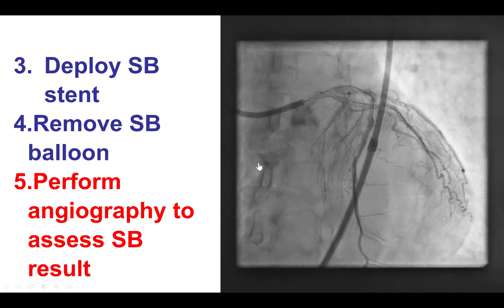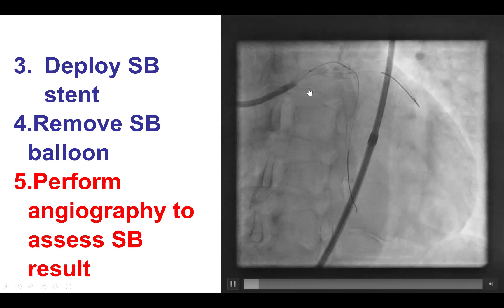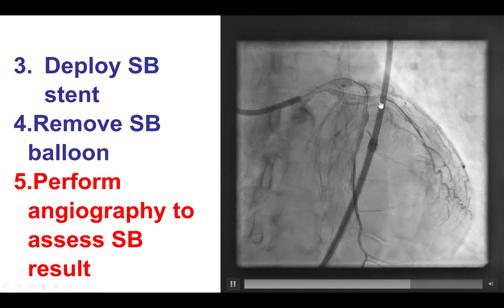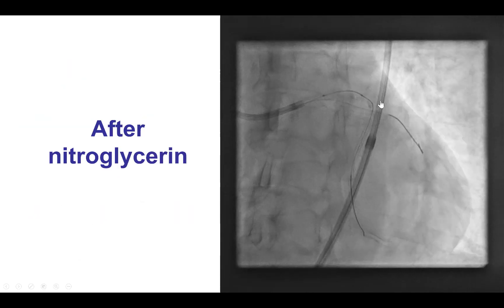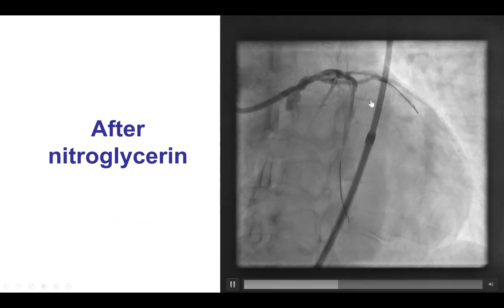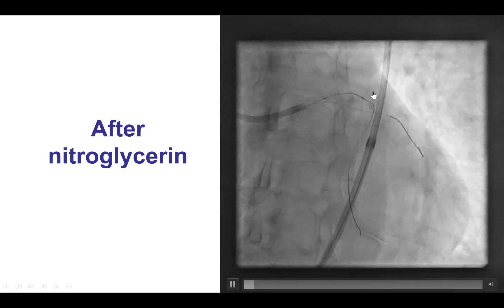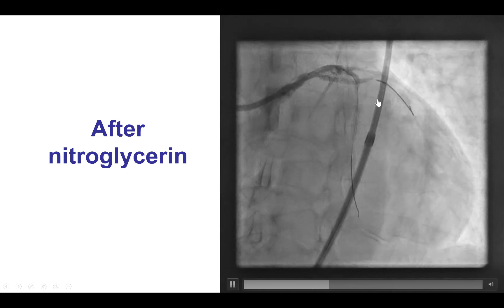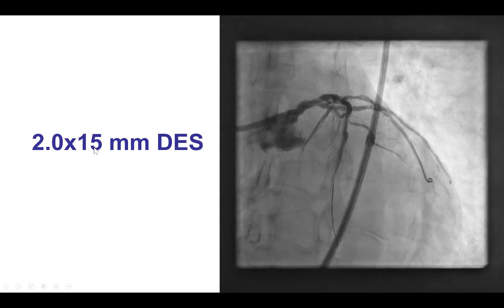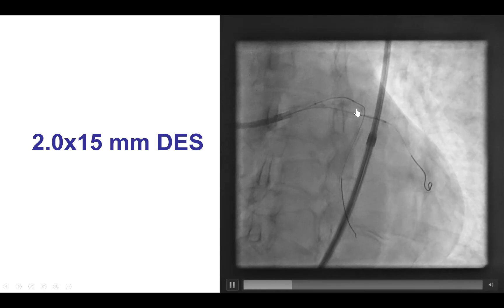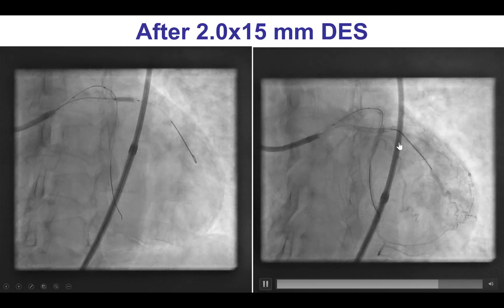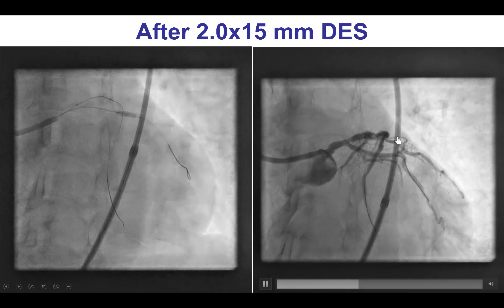Before crushing the side branch stent it is important to make sure the result is adequate. There was something at the distal edge of the stent that was of concern. We gave nitroglycerin to see if it was spasm, but there remained a lesion, which likely represented a distal edge dissection. Therefore, we decided to cover it and placed a small 2.0 by 15 mm drug-eluting stent that successfully covered the lesion, providing a nice result into the circumflex.